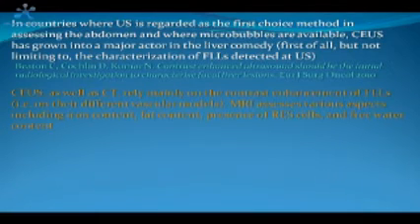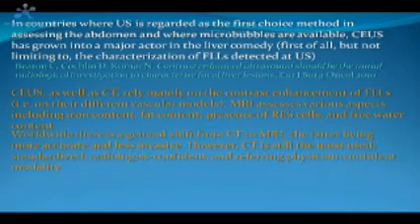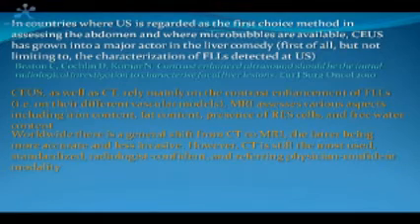And of course we must consider that CEUS, as CT, only relies on the knowledge of the vascular model of the lesion and on the perfusion behavior. MRI is a more sophisticated imaging modality, and it is based on a number of different aspects of the lesion to be considered.